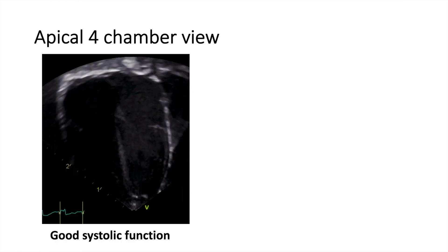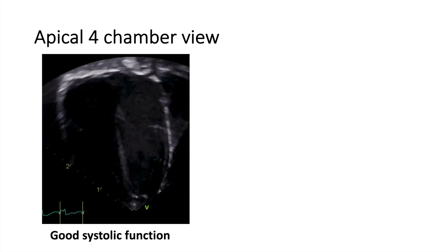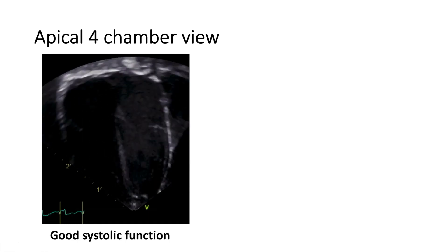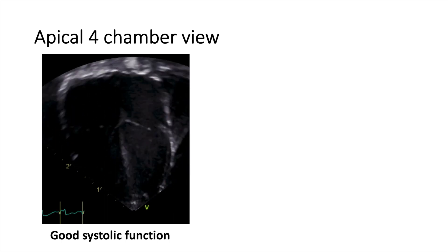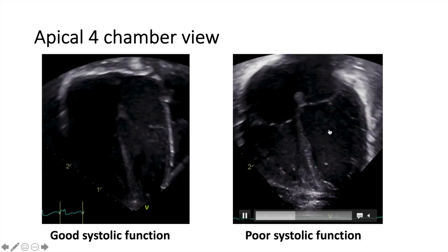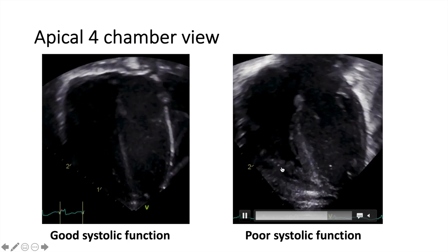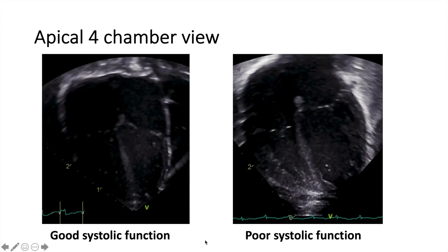What do we look at in this view? You can subjectively say that there is good systolic function. You can see the LV contracting well here, as well as the RV. Obviously you need to quantify it and do some measurements, but we're only doing a POCUS study at this point. This is good systolic function as opposed to poor systolic function — you can see the LV is barely contracting, the same for the RV. This comes with more experience. So this is good systolic function versus poor systolic function.